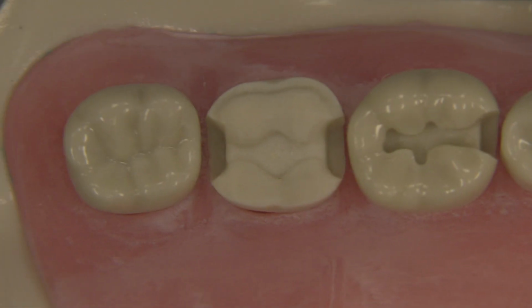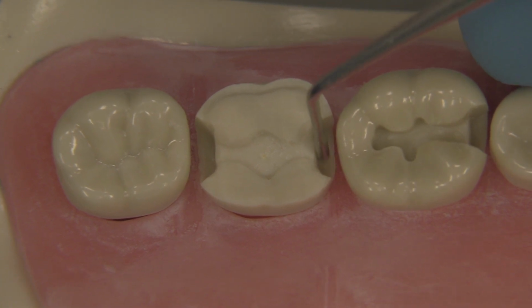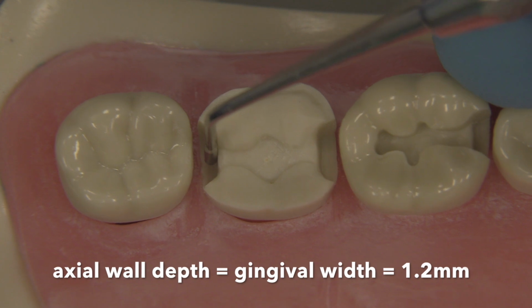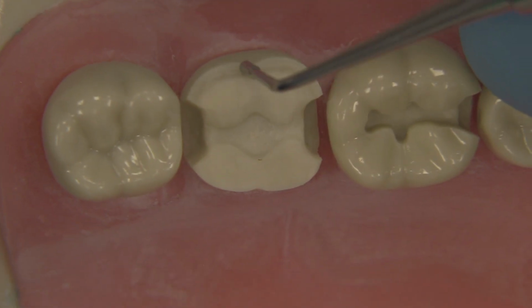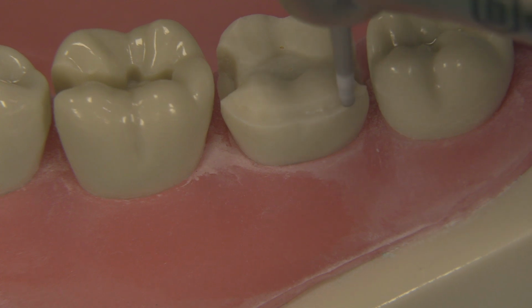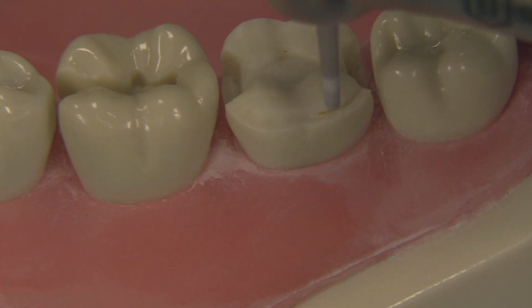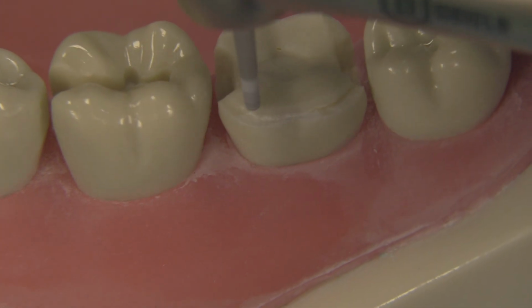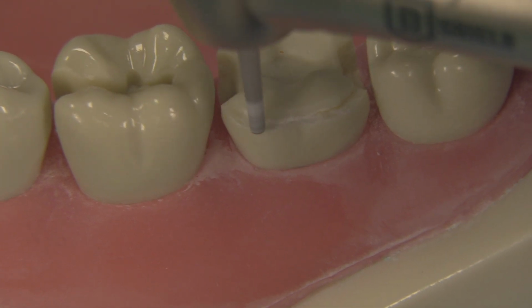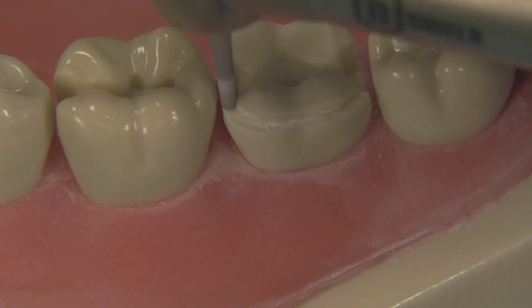I think these are probably a little bit on the deep side. Oh, and that's pretty good. Oh, what do you know? 1.2. What can I say? Just a little conservative, so we'll go a little deeper there. Make sure it goes all the way through like it is right there. And if it sweeps uphill a little bit here, see how you can kind of tease it back?